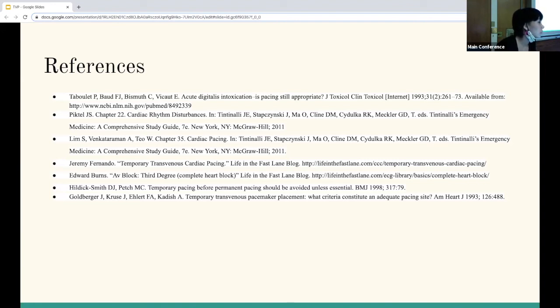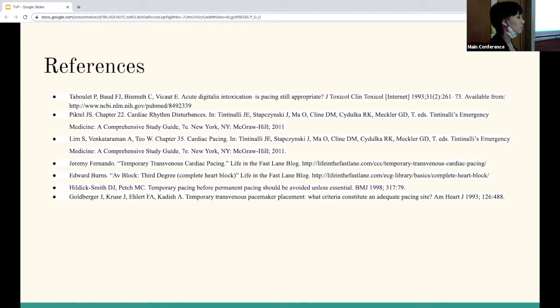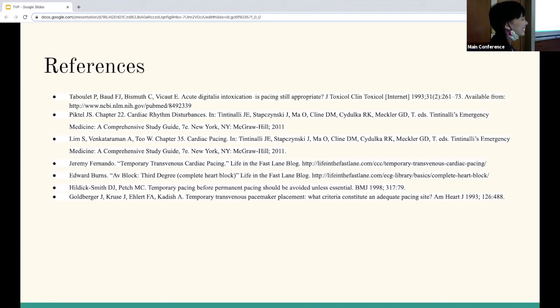There are two ways to monitor if you're in the right place. One is as shown in the video: you go in watching the patient on the monitor and look for that monophasic curve of injury, and as soon as you get that, you know you're in the right ventricle and you're hooked up to the pacer. The other method is to take an alligator clamp and put it on the V-lead and attach it to the negative pole of the pacing wire. As you advance, you can see the P-waves change — going from inverted to upright as you enter — and then you see the monophasic curve as it hits the RV. Then you hook it up to your pacemaker. So there are two different ways: one is just go in and connect it, and the other is to use the EKG to guide placement as you're advancing.